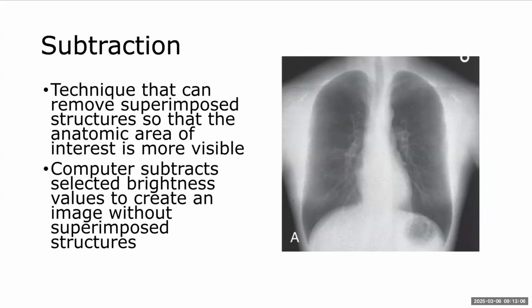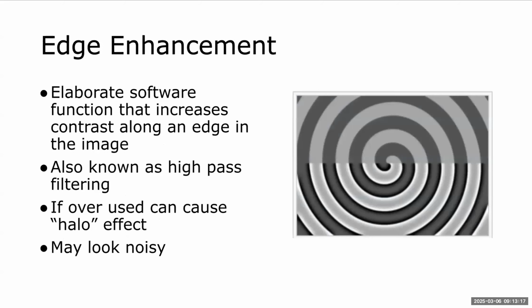There's another picture, I believe, in your book that has the soft tissue structures subtracted out, and all you see is the bony thorax. So it's just a different function that is generally available in post-processing. Or when you're doing fluoro procedures, things like declots, you can do subtracted images so that you're subtracting out all the bones and stuff, and all they see are the vessels left.